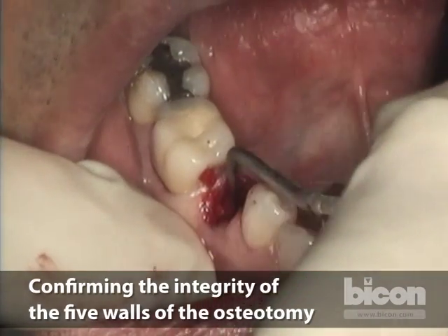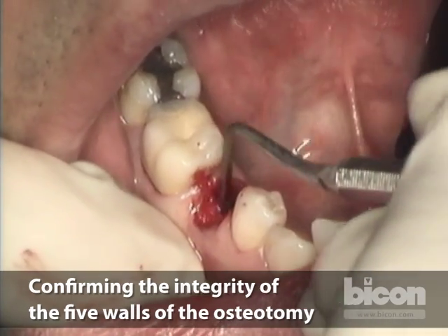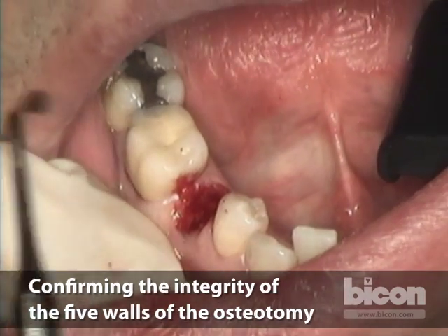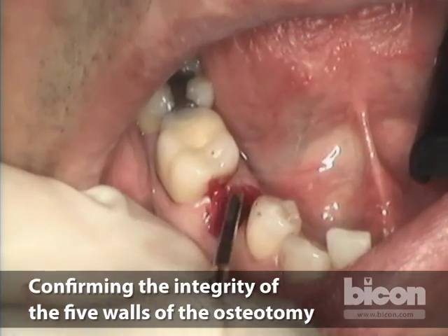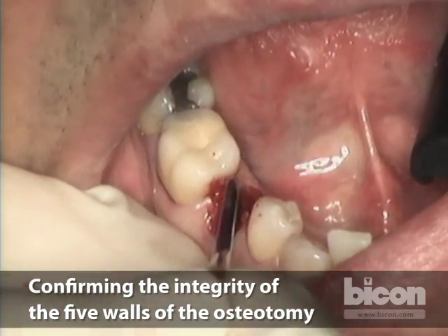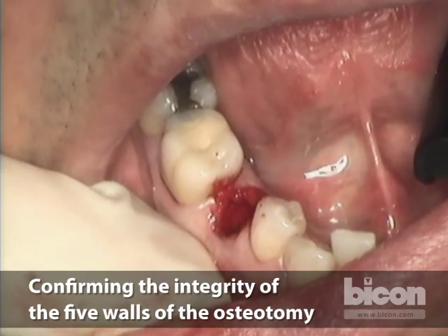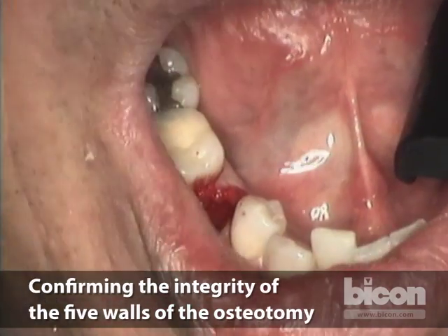Now as we're getting close to the final size — before committing to the four and a half or five millimeter diameter, since both are options — I will take a curette and make sure we have no unforeseen occurrences such as a fenestration, dehiscence, a fracture, the feel of a root, or a very soft floor of the osteotomy.